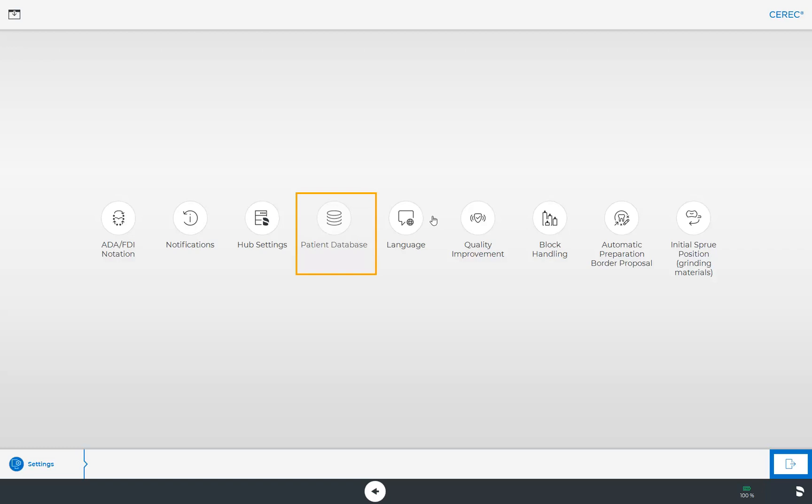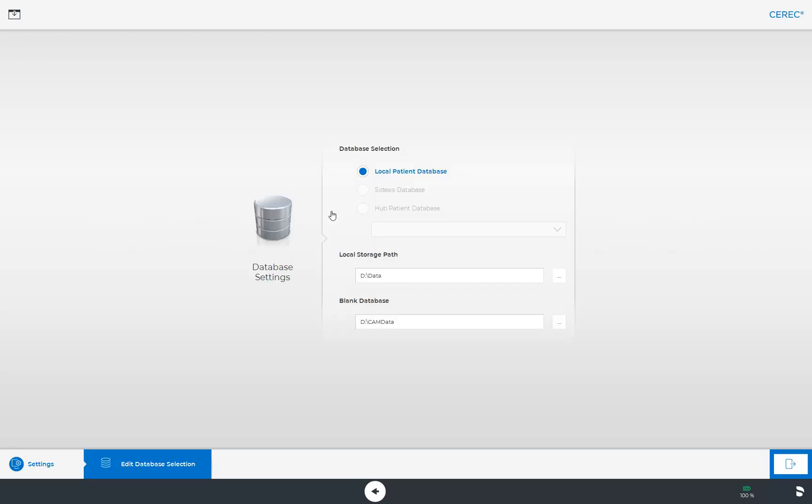Next, we will take a closer look at the Patient Database. This menu item allows you to determine where your patient data and cases will be saved. You can choose a directory for these data. For example, all data can be saved to a secure server in the practice network this way.